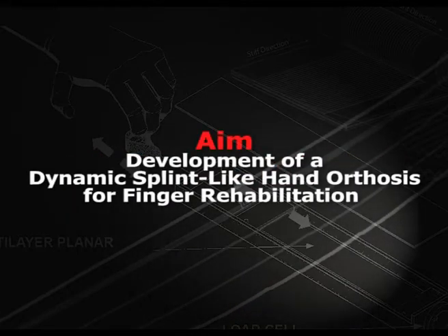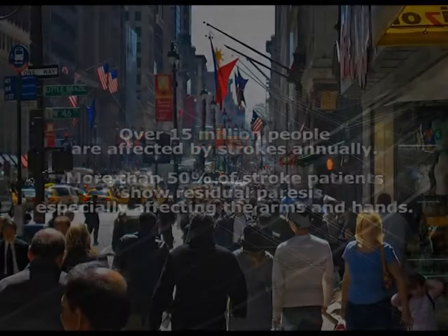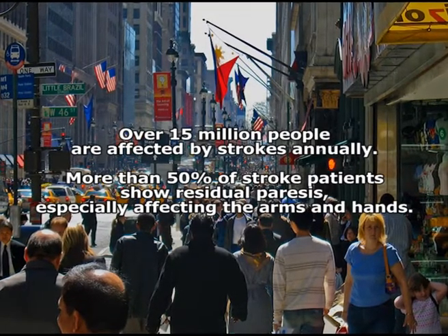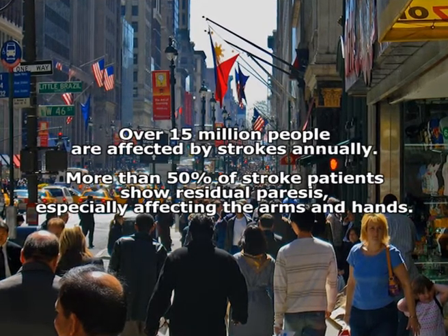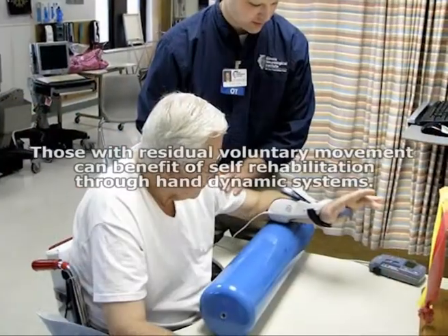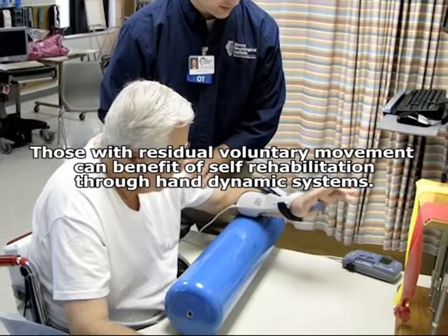The idea is to develop a dynamic splint-like hand orthosis for finger rehabilitation. Over 15 million people are affected by stroke annually. More than 50% of stroke patients show residual paresis, especially affecting the arms and hands. Those with residual voluntary movements can benefit from self-rehabilitation through our hand dynamic system.